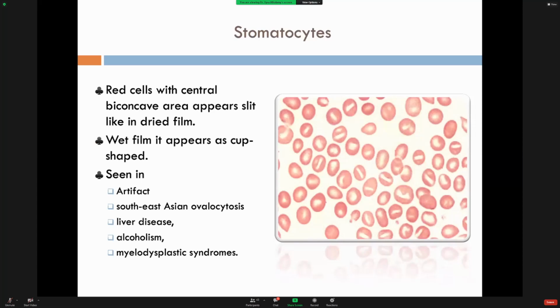فأنت حتشوف السايز أكثر إذا كان معك ميكروسكوب وتحركه يمين يسار تقدر تشوف. إذا كانت صورة زي كذا ما حقدر أسألك عليها، صعب إني أقدر أسأل طالب طب إنه this is a micro ولا macrocytic. سؤالي حيكون واضح إنه حتكلم عن الستوماتوسايتس هنا. إيه تمام، شكرا لك. طيب.